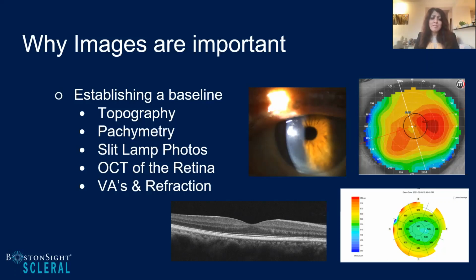Avani, is there anything that I'm missing here that you do? No, I think you actually said it perfectly. And I think, like you said, it gives you a sense of confidence as a provider, but it also enables a little sense of trust from your patient when you're able to show them these baseline images so that they can see progression over time.